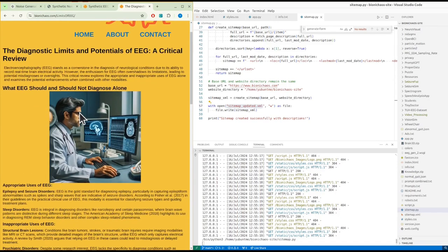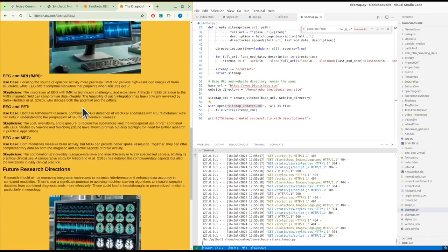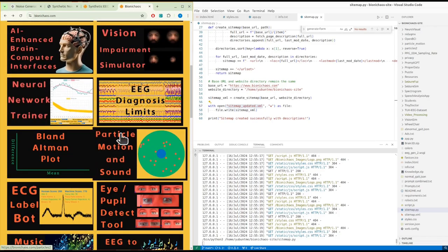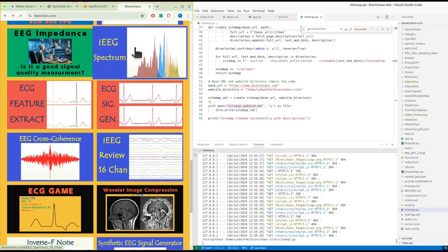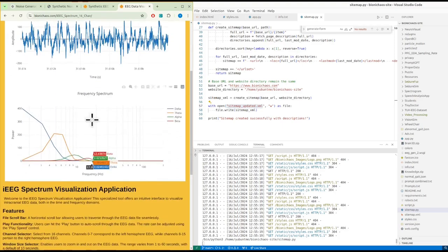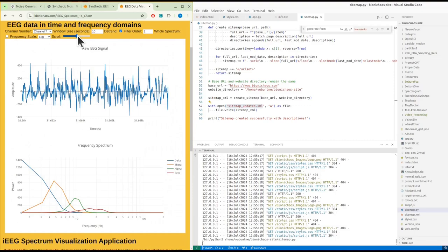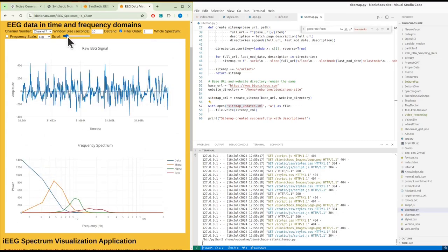That will look more like baseline EEG. We have some blogs on the topic as well, the diagnostic limits of EEG. Go check it out. Yes, we are writing everything with AI, with LLM, but this one we need to fix because it's loading forever. There is a lot of backend. There's a large data file in the backend. It probably doesn't have to be that large.